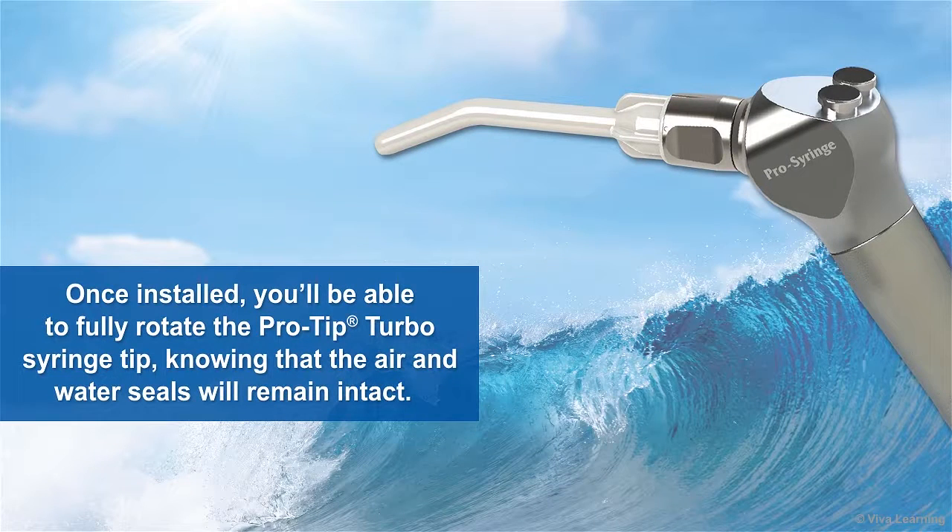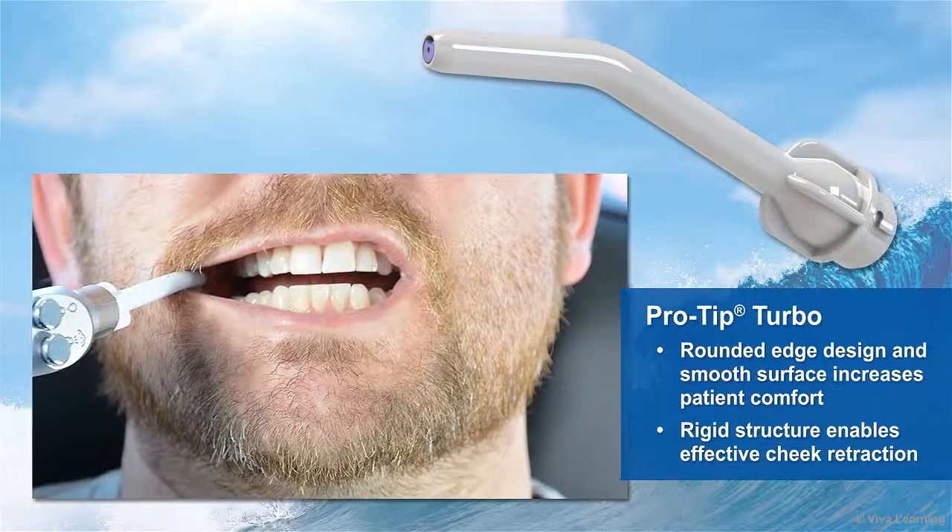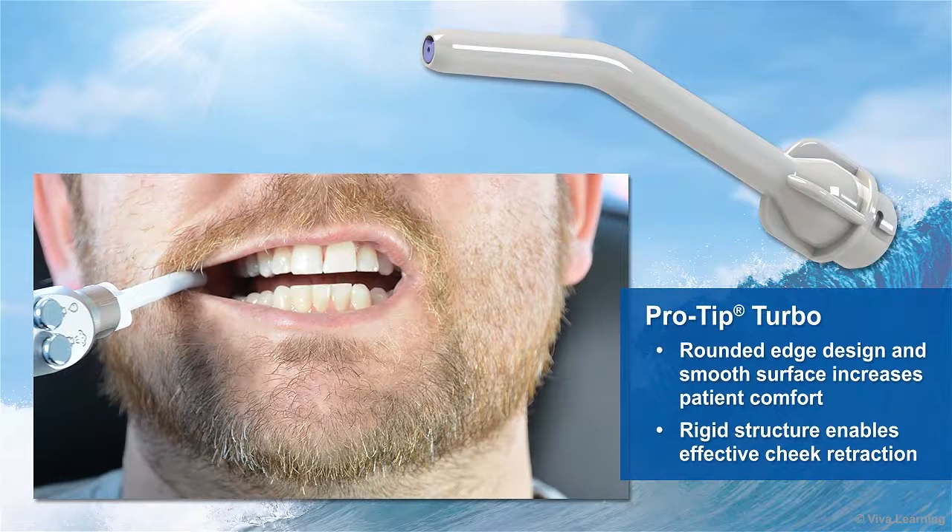Once installed, you'll be able to fully rotate the ProTip Turbo syringe tip knowing that the air and water seals will remain intact. The tip's rounded edge design and smooth surface increases patient comfort, and as you can see, its rigid structure enables effective cheek retraction.